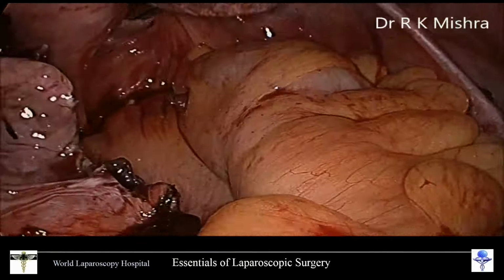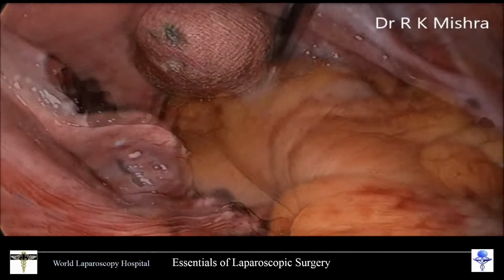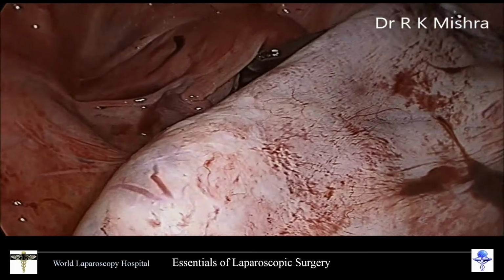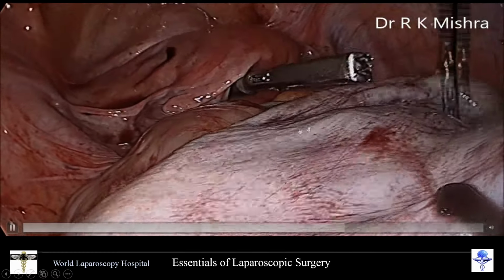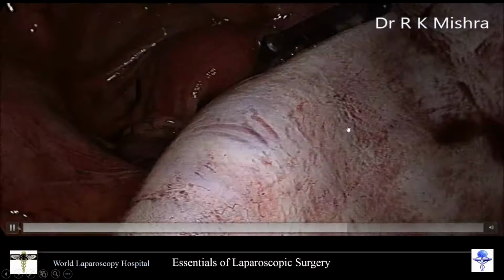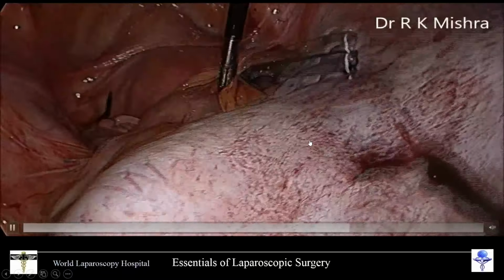So, there is a sponge inside, and then the sponge will be taken out, and by the side of the sponge you will put the claw forceps. This is the claw forceps. Here, by the way, this is the tube, this is the round ligament, this is the iliac vessel. So, this is a traumatic claw forceps which will pull it, and then you will start dissecting it.